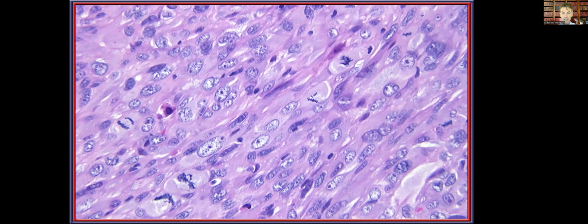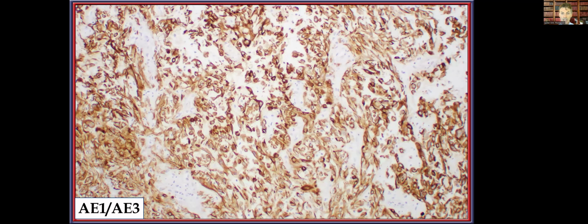Generally, mitotic figures are quite easy to identify. Here I'm highlighting 5 or 6 different mitoses, including atypical forms. And when you see them like this, they certainly will help you to reach the correct interpretation. Here is an AE1/AE3, very strongly and diffusely reactive in this neoplastic proliferation. Here is an example of the P40, and I'm just going to use those two just to highlight what you're able to see within this tumor category.